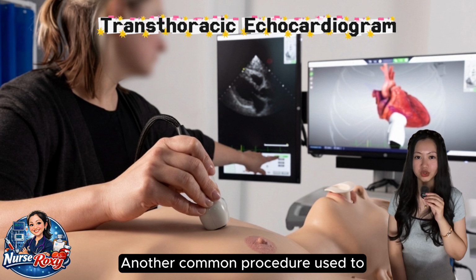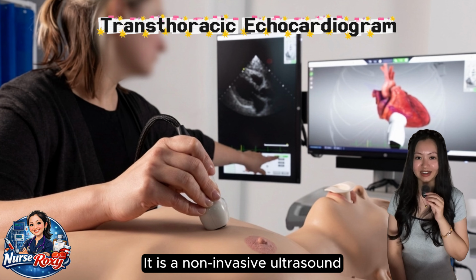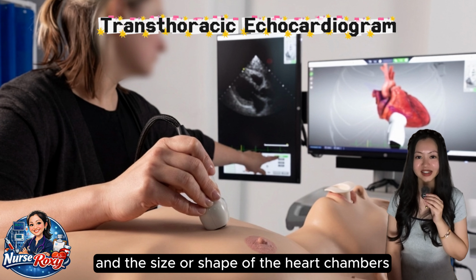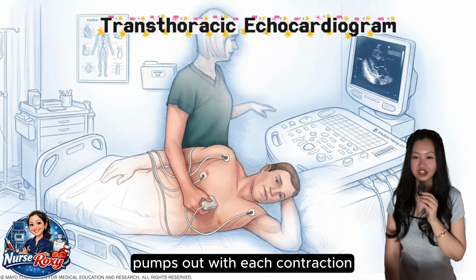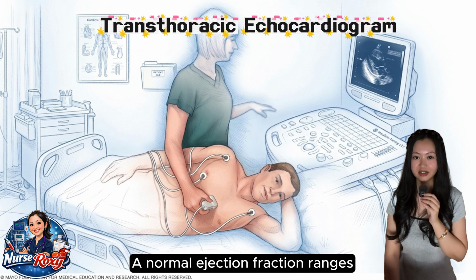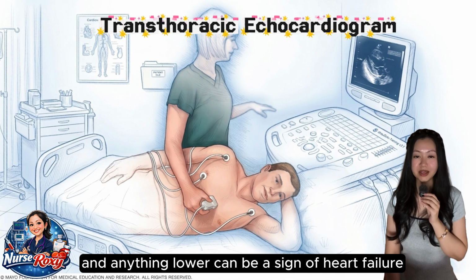Another common procedure used to assess the cardiovascular system is Transthoracic Echocardiogram, TTE. It is a non-invasive ultrasound performed on the chest wall. TTE is used to assess the functioning of the heart valves and the size or shape of the heart chambers. TTE also measures the pumping ability by calculating how much blood the left ventricle pumps out with each contraction, also known as ejection fraction. Normal ejection fraction ranges between 55 to 70%, and anything lower can be a sign of failure.